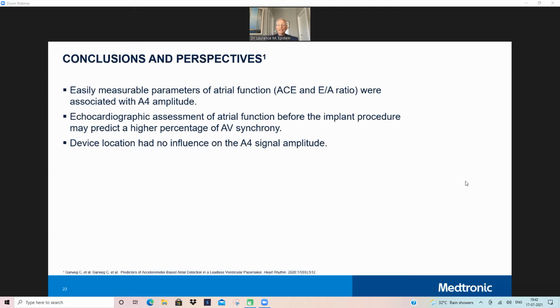For younger patients who present with heart rates in the 80s or 90s, and are going to exercise and get their heart rate up to 110, 120, 130, this is not a great device. In people that might have intermittent heart block where it's not going to be pacing all the time, or in some patients where it just needs to kick in, that's fine. In some patients with higher heart rates, I've achieved better AV synchrony by putting them on beta blockers and slowing their sinus rate.